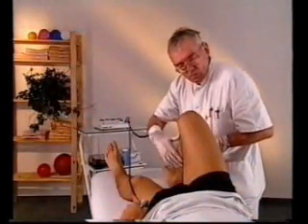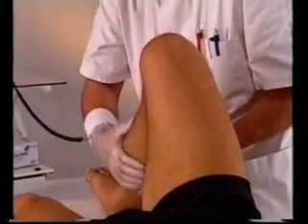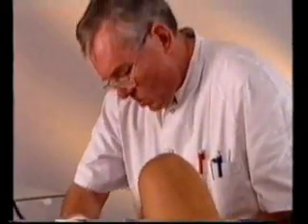Resonant vibration causes a pumping effect on the tissue segment undergoing treatment. In disturbed conditions, the treatment very quickly causes improvement in the removal of wastes and uptake of nutrients, as well as lymph flow activation. The subsequently intensified hematoma disintegration, suppression of inflammation and reduction in tissue pressure results in enormous pain relief and muscular detonization.